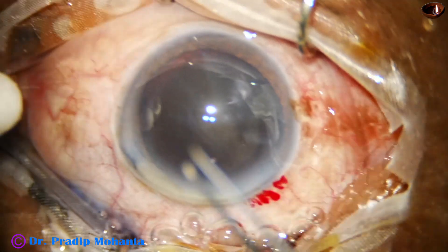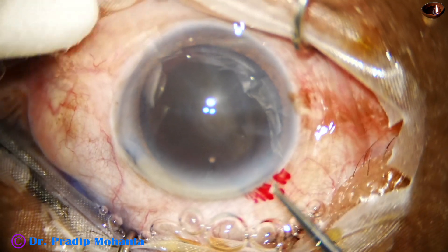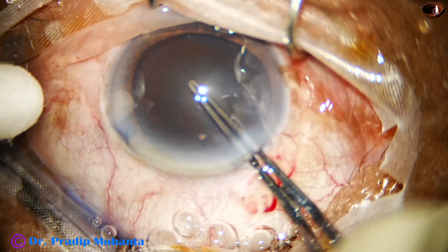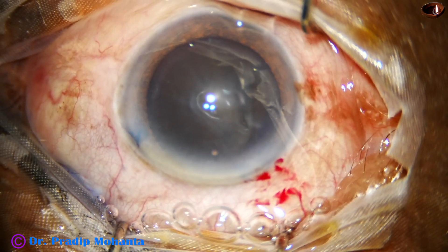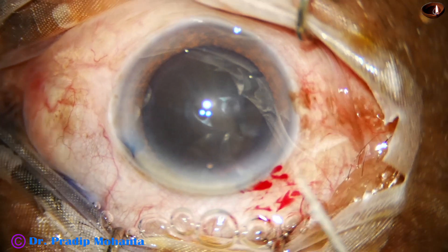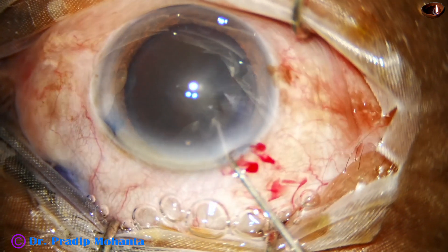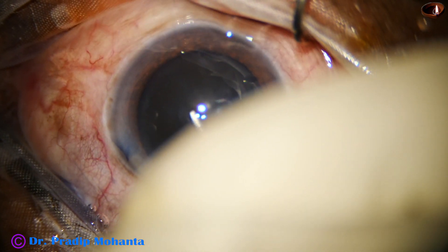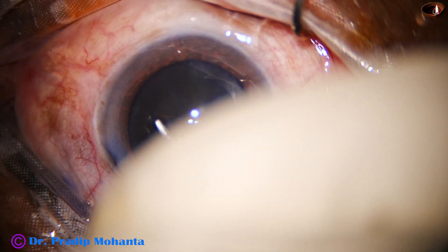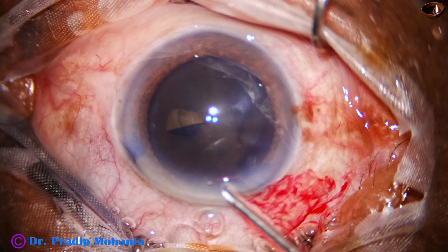And now, I am trying to make a puncture with the utrata forceps, and I find that it is difficult. There is a star fold, so I take a sharp needle, make a cut and pull, and I raise a capsular tag.